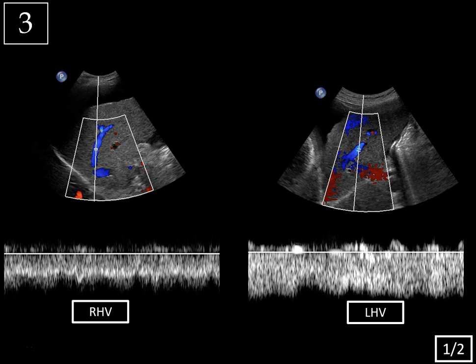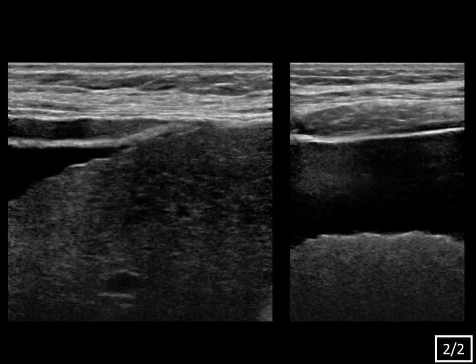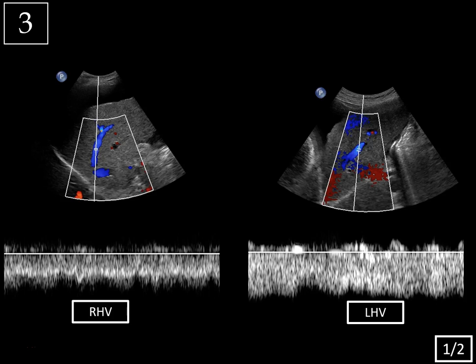Next case, slide one of two: right and left hepatic veins. Slide two of two: linear images of the hepatic surface. These waveforms look very different from the hepatic vein waveform we just looked at. The direction of flow is normal — it's blue, going away from the liver towards the heart and below baseline — but instead of a triphasic or tetrainflexional appearance, it has more of a monophasic appearance with decreased phasicity or decreased pulsatility.